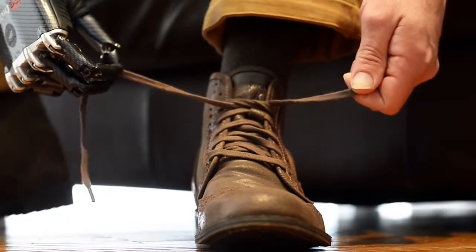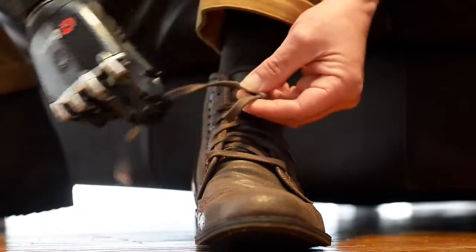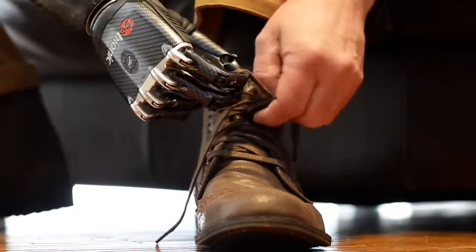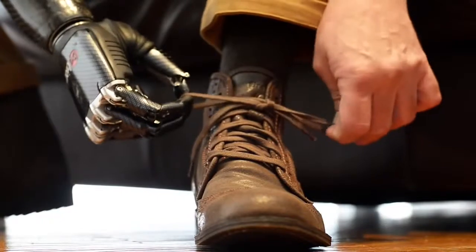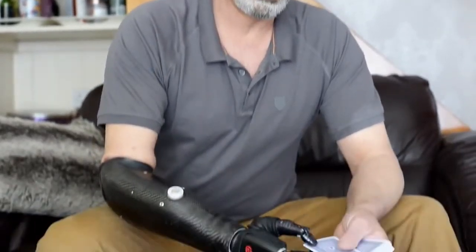I do my thing with my left hand — I'm just holding it now — open signal, then come back in, a close signal, and then pull. Just little things that you would normally take for granted.